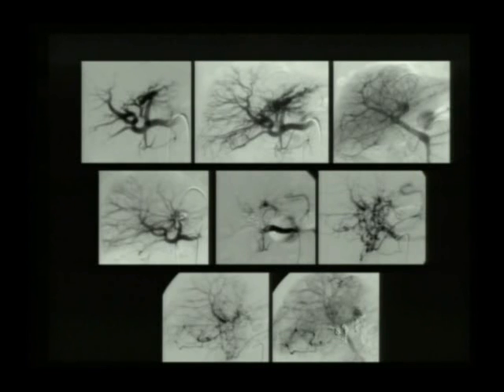Well, the story didn't end there, because what I would have liked to have done was to try and get some agent out to the periphery of these, but regrettably he had some proximal coil embolization, and so all this did was promote arterial collateralization around the porta hepatis in an attempt to arterially revascularize his own liver. So over several years, we've been going back in and trying to top up with some glue embolizations, because he was having recurrent GI bleeds and frequent blood transfusions, and so we've kept things in abeyance for a few years with him, but it takes a lot of work, and he's doing relatively well, but ultimately he will require a liver transplant.